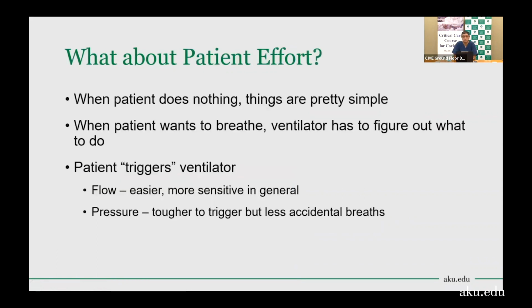So what if the patient starts breathing? When the patient does nothing, things are pretty simple. We have the patient paralyzed, so they're not doing anything, but that's not how the patient is going to be. Eventually the patient will wake up, or we will wake the patient up. We will turn the medication off, the sedation off, the paralysis agents off. Please note that you should turn the paralysis agents off before you turn the sedation off. It is very important that you have a patient sedated and then paralyzed rather than paralyzed and not sedated. That would be very, very horrible.